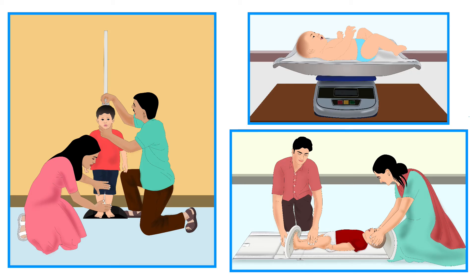Anthropometry is the most frequently used method to assess nutritional status. Anthropometric measurements include height, weight, circumferences, etc.